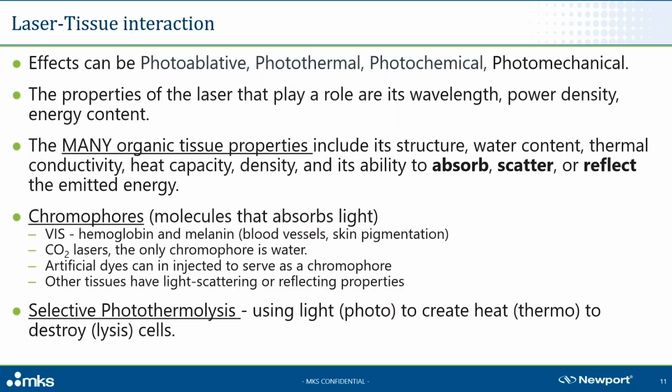So what happens when you shoot a laser at human skin? Well, it turns out it depends on a lot of factors. While it's true a high-powered laser focused down to a very small spot will produce an extremely high-power dense beam that will instantly vaporize or ablate anything in its path, more often, in medicine, we are generally talking about tightly controlling the laser beam properties to accomplish a specific task, such as delivering thermal energy or causing cell death through a chemical transformation process.